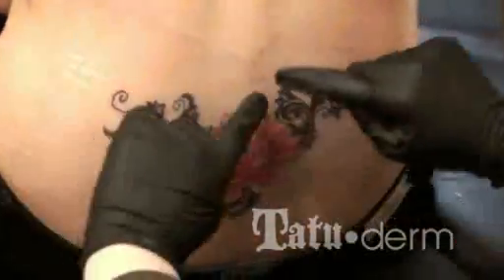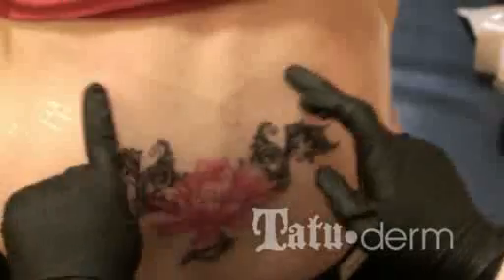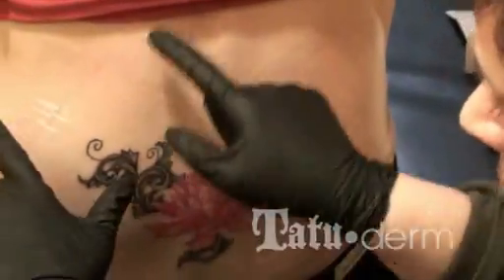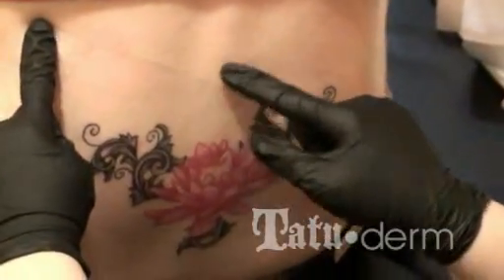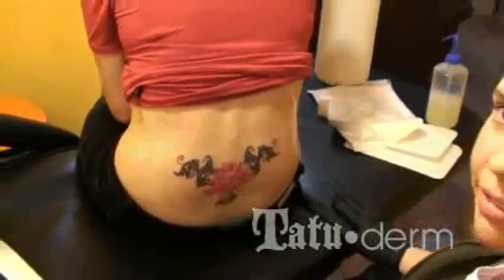If you're worried about any creases at the top, that's where you need to be a little more careful about the adhesion. Creases may let water in if they're showering, so put some white cover roll or Mepore at the top to make a good seal. Same with the bottom, and you'll be done.